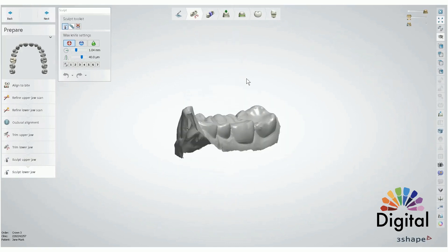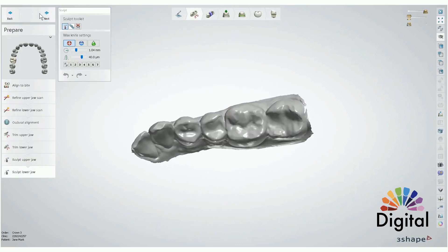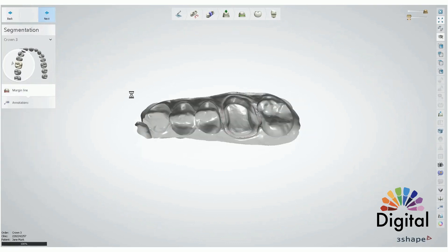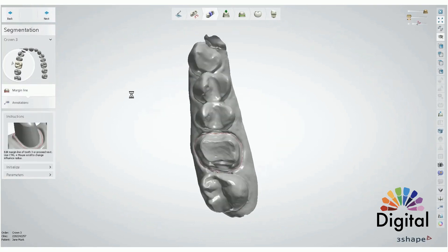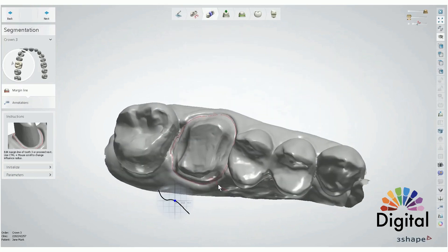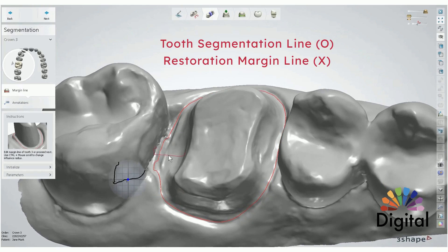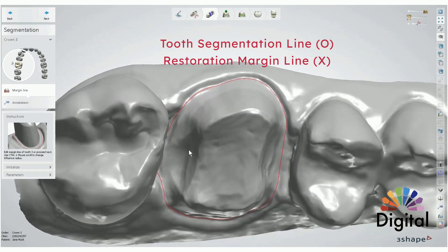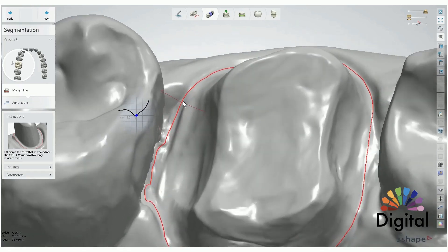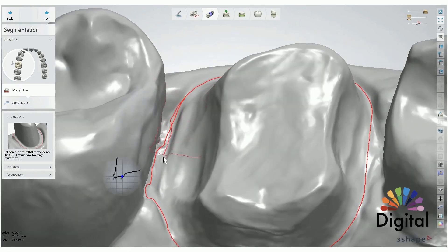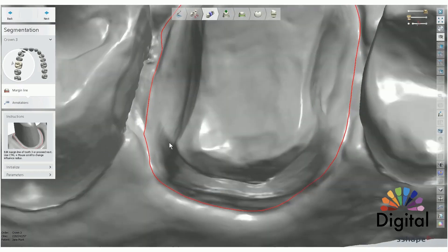Lower jaw has the same tools and same functions. Click next to get into the next step: segmentation. In segmentation, we want to draw a red line for the tooth segmentation line. This is not for the restoration margin line. We can draw the line following the margin line — that's fine.